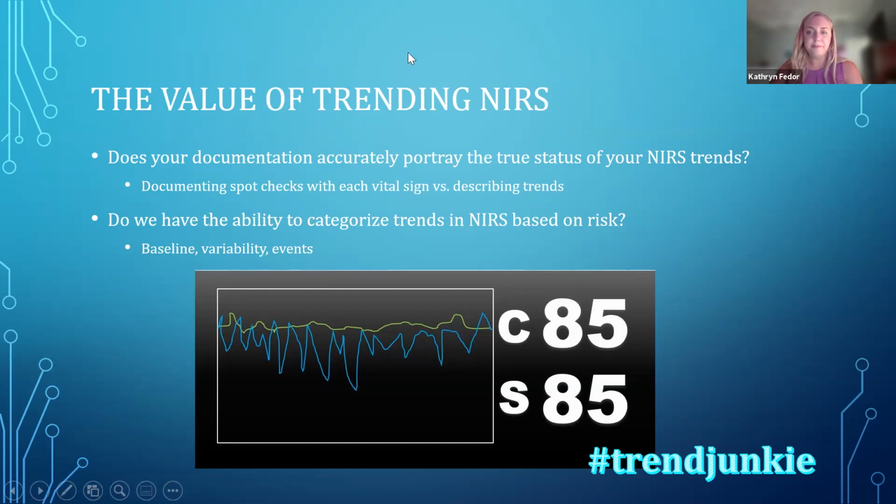One thing that we consistently encourage of our team, even though, as I mentioned before, we place a lot of value on these absolute values that we chart, is that documentation certainly is important, but we really emphasize to our team the importance of trends. And with NIRS, that seems to be of utmost importance, especially for the small baby population. We keep questioning these things and trying to look at them differently.